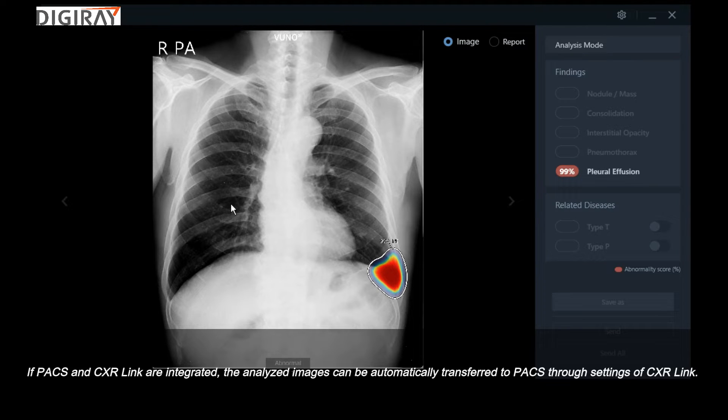If PACS and CXR link are integrated, the analyzed images can be automatically transferred to PACS through the settings of CXR link.